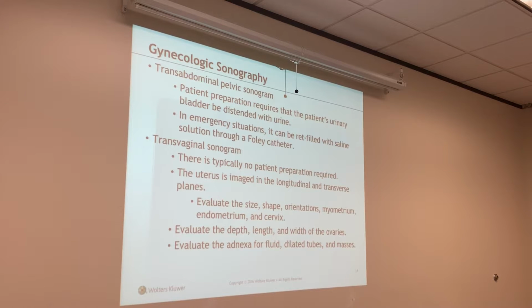We're going to look at the endometrium. The endometrium is going to change according to the hormones that my body is putting out with my menstrual cycle. Okay? Anytime I measure something, it's going to be in 3 dimensions. The length is always going to be first. I'm also going to look at the adnexa.